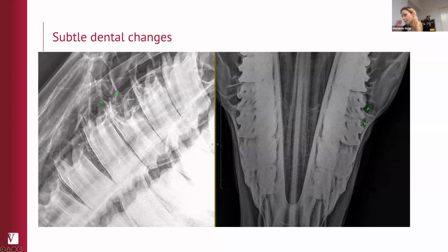However, we know that this radiographic finding per se is not quite as sensitive as others for diagnosis of infection. So I would probably still recommend CT in this particular horse.